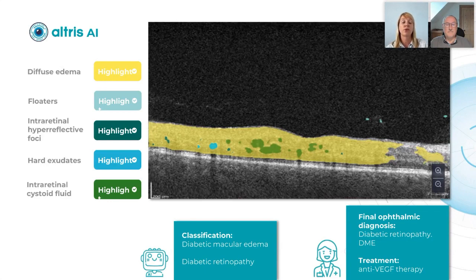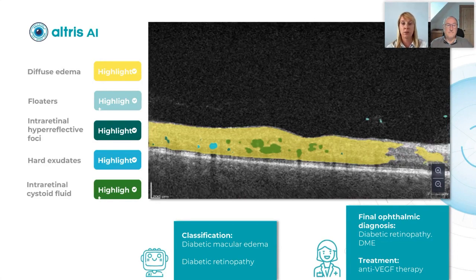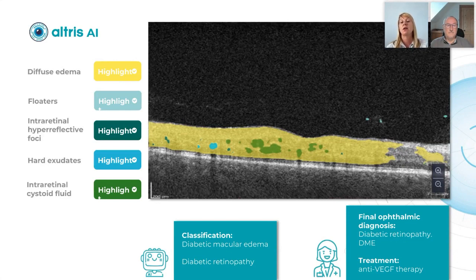Intraretinal cystoid fluid was also detected, and the AI classification was diabetic macular edema and diabetic retinopathy. She underwent different examinations, the final ophthalmic diagnosis was diabetic retinopathy and diabetic macular edema, and she was prescribed anti-VEGF therapy.